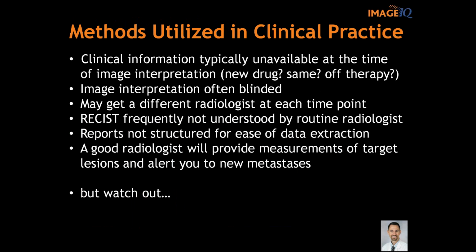Okay, so just in general, how do we use this in clinical practice? It was interesting. I was just at a national meeting, and a few people were saying, we use RECIST every day as radiologists. And I sort of argued that, well, we try to, but I don't know that we really do. I'll explain that here. And this is why you might want to consider a core lab and software and so forth, because your radiologists may not be using RECIST exactly as you think they are.